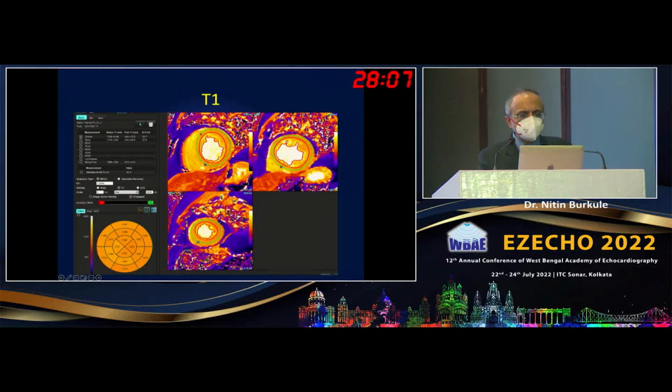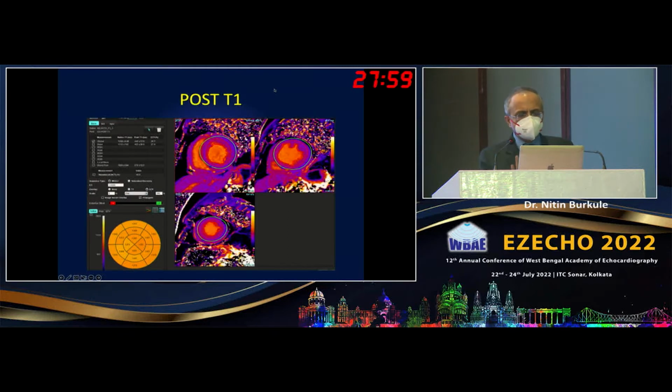So you take this T1 characteristics, which is a very objective data, before giving contrast and then after giving contrast, okay, like this, after giving contrast. You subtract the two, you know the change in the blood volume. In the blood volume, you know the extracellular volume because you know the PCV. So in the blood, you know what is the extracellular volume, and you know the same ratio of change in T1 would be there in the myocardium. So you can get an extracellular volume by this method, and this is probably the only method by which you get a myocardial extracellular volume in an intact patient. So here we can see that extracellular volume has increased.